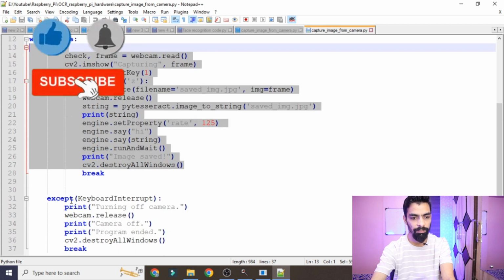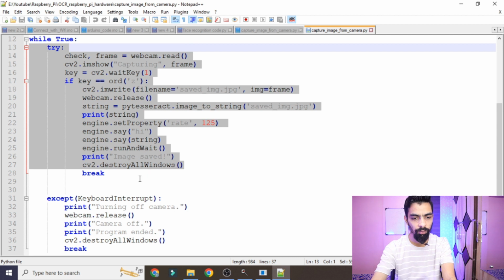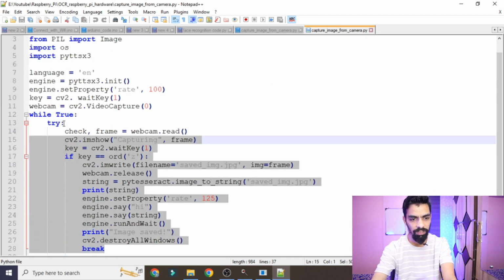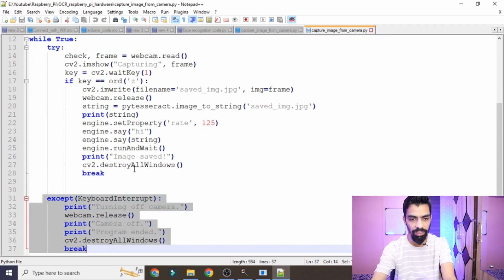Then you can see the except part: if any error happens, you will get it in the exception part. You can see camera release and directly cv2 all windows will be destroyed. All this part is basic. So the main logic is here only. Try is the main logic, and except is nothing but to handle the error. If any error happens, then in that case we have to release the camera and destroy all the windows. That part is written here.